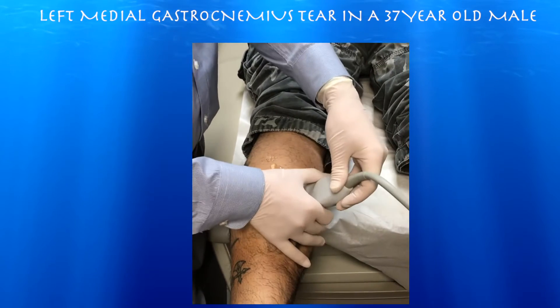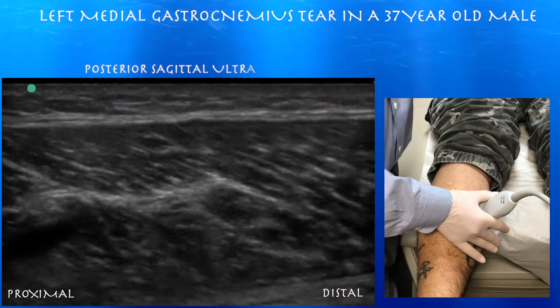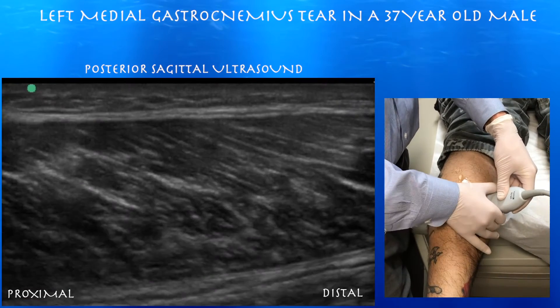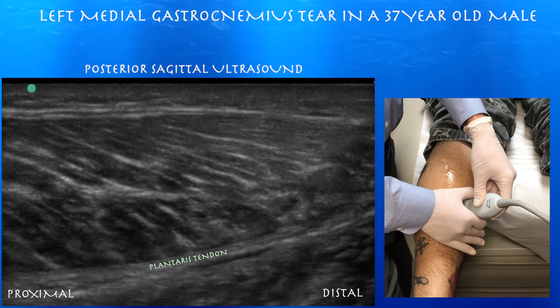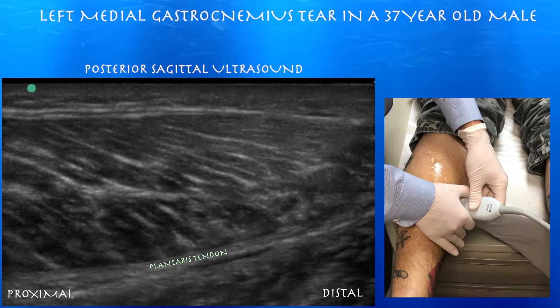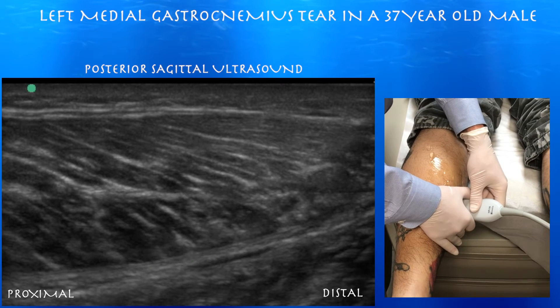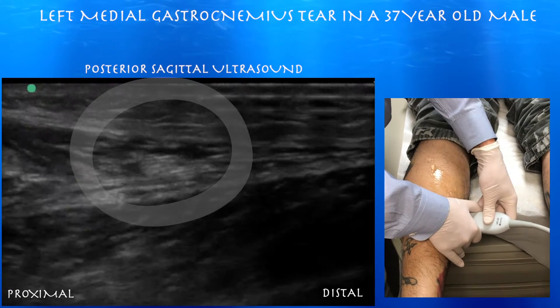Here's our first clip. Right side of the screen is distal. We're looking at the medial gastrocnemius muscle. Not very tender up here, but as we move distally it's starting to get tender. And here we are — just a little bit of irregularity at that distal muscle. It's got a little bleeding.